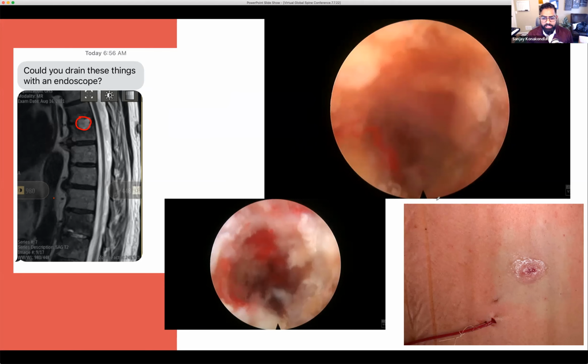For me, typically, the flow regulation and the pressure regulation, we keep our numbers on the lower end. So we don't see a lot of issues from that. We use the same settings that we do for lumbar spine in the thoracic spine because they're not as high as some folks, and we don't feel like it needs to be.